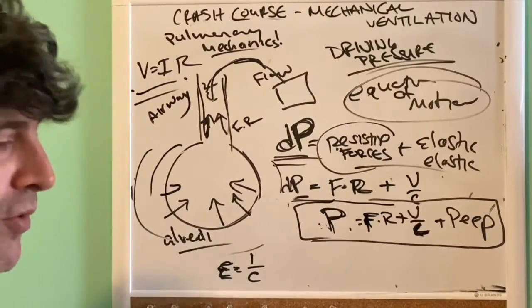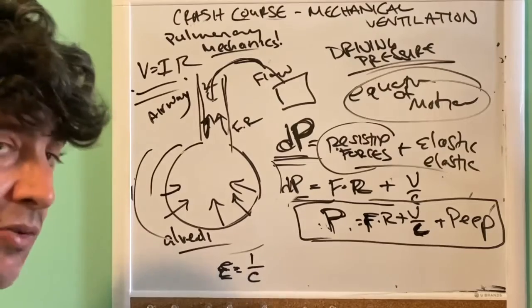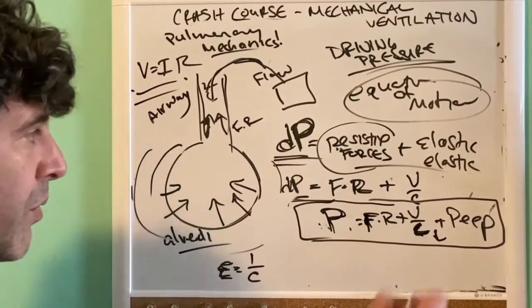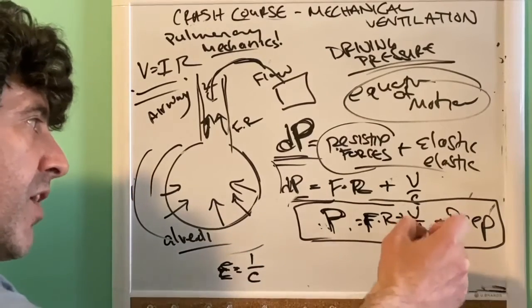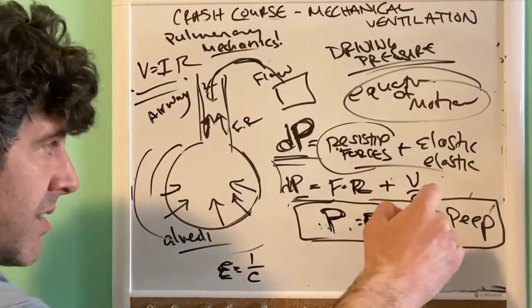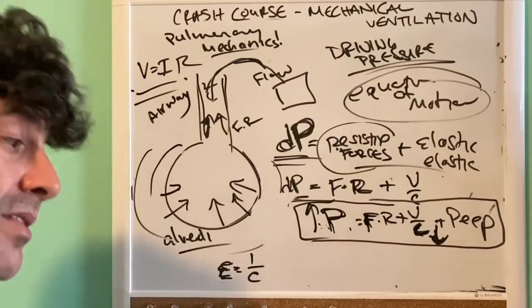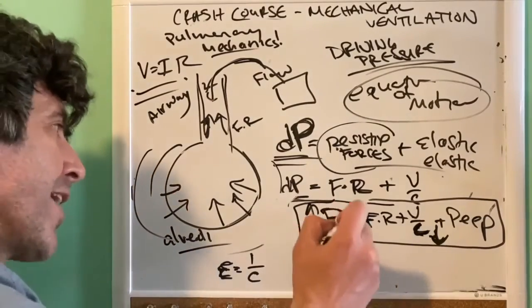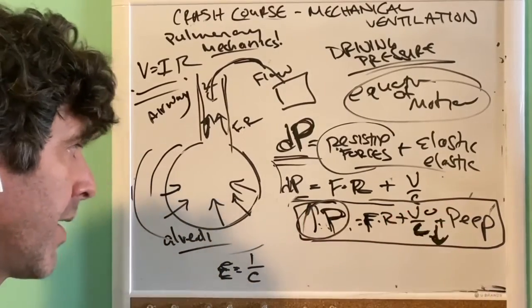Your lungs would fill up with fluid, you'd have a tremendous amount of pulmonary edema, and your compliance would decrease. So what would the vent have to do to achieve that pressure? Well, if your compliance decreases, then this overall increases because your denominator decreases, and your pressure would have to go up. That's why, as people get worsening compliance, you're going to require higher pressures to achieve that same volume.